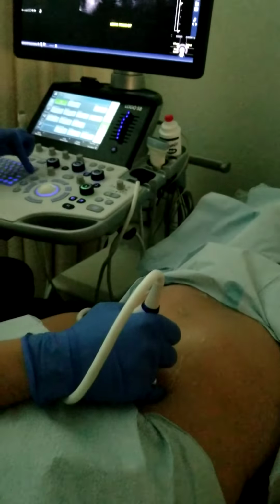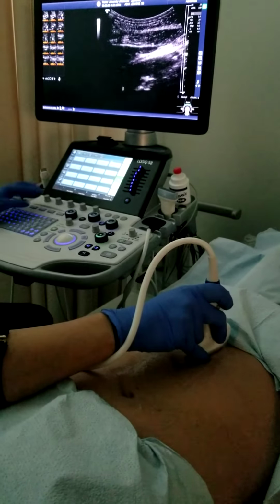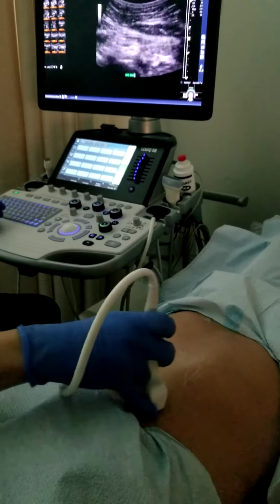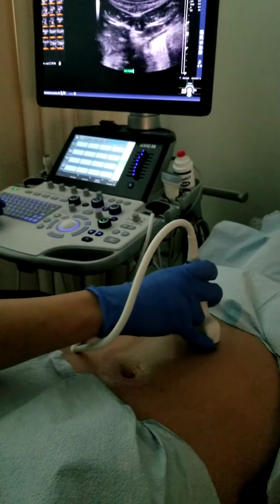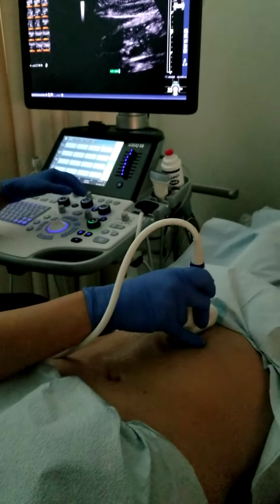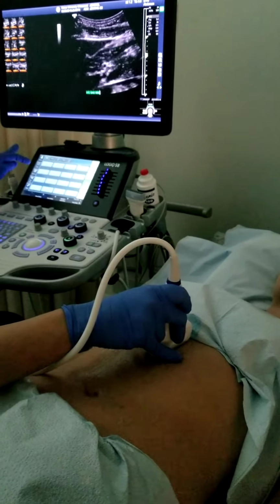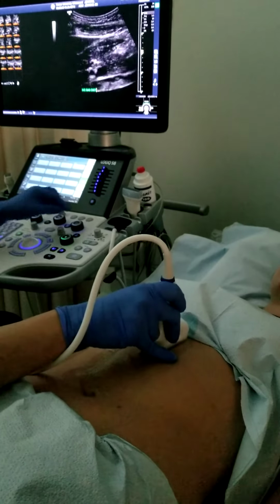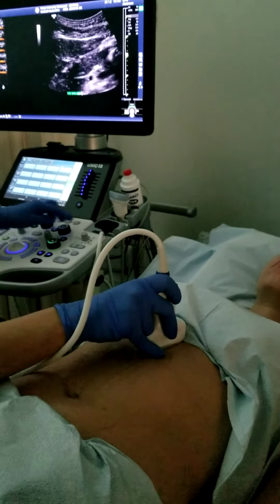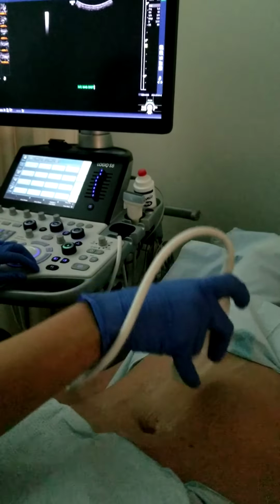Okay, last image of our aorta IVC protocol is the IVC. So, IVC, sag, and remember that the IVC originates where the iliacs converge together and then it travels up the abdomen. So this portion here is actually distal IVC. Okay, distal. Because here the vessel was more anterior and I'm coming back up here, and now the vessel is going to be more posterior, so I need to bring down my depth so I can see my anatomy again.